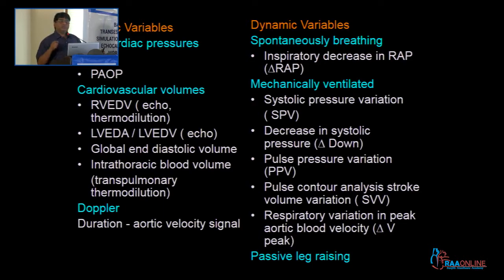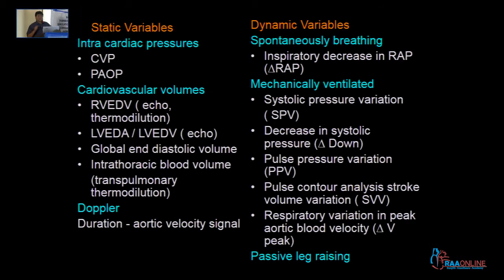Now, what do you mean by a dynamic parameter? A dynamic parameter is nothing but a parameter that changes with a hemodynamic challenge. Now, what is the classic hemodynamic challenge that you give? You give volume. When you give volume, you're trying to increase the preload, and you're thinking, is this increase in preload going to change the cardiac output? Now, without giving fluid, how can you measure this?